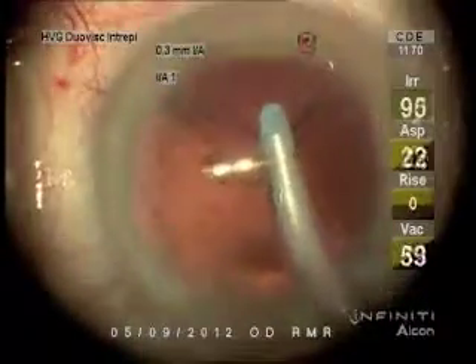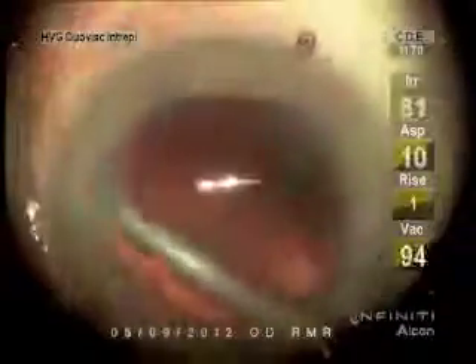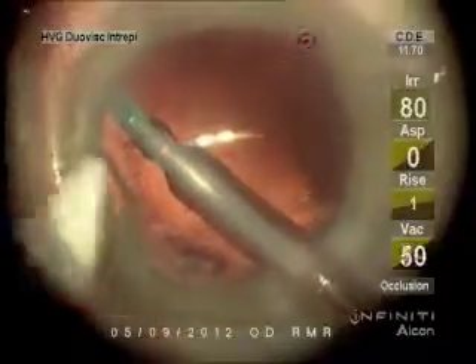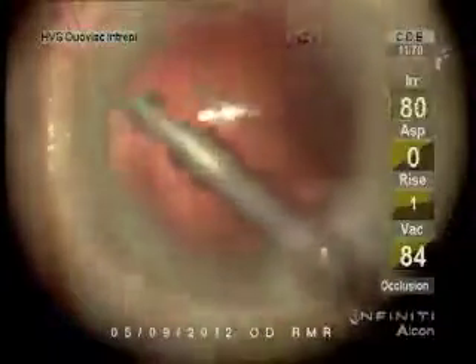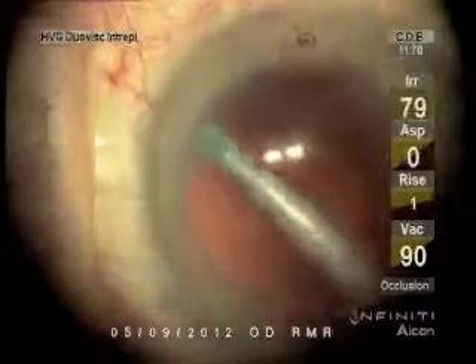I have two vacuum limits for the IA. Lower the vacuum — it's hard to get a really low vacuum when you have a high maximum. Better to really feather your foot switch with a lower maximum. It's easier to feather it and get that sub-incisional cortex to drag out rather than tear off.